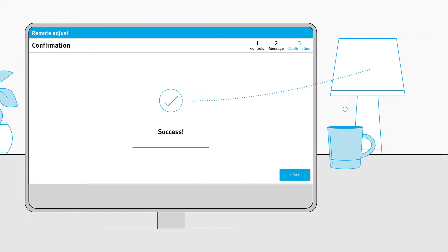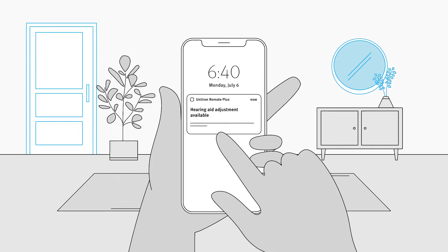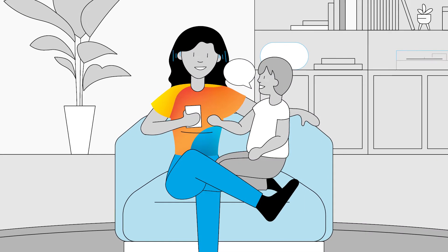Your client will get a notification on their smartphone, letting them know an adjustment is available. Applying the adjustment is easy. They'll open the Remote Plus app, navigate to the new adjustment, and tap to apply the changes. They'll be able to hear the difference right away.